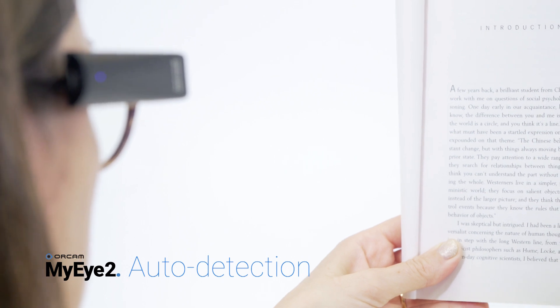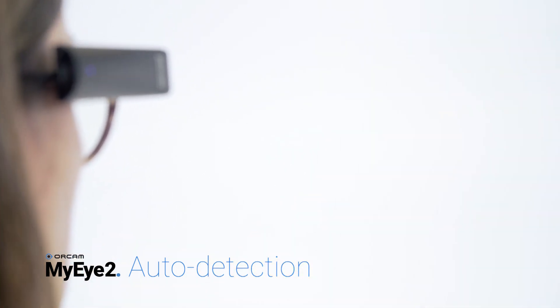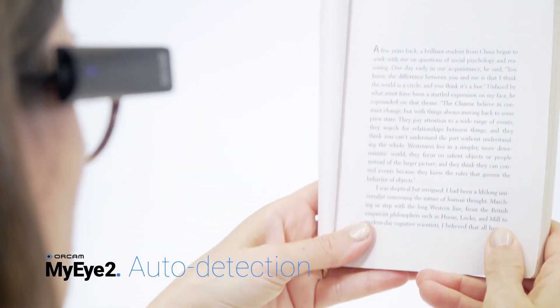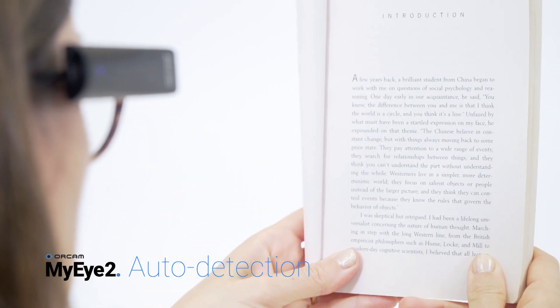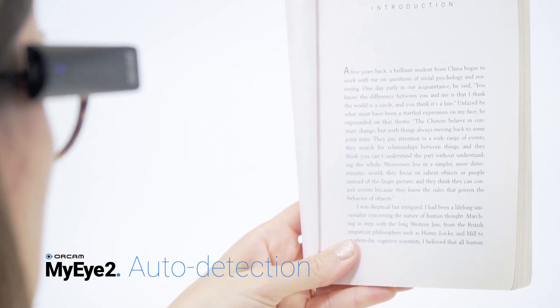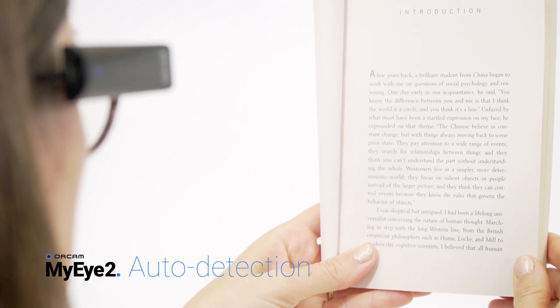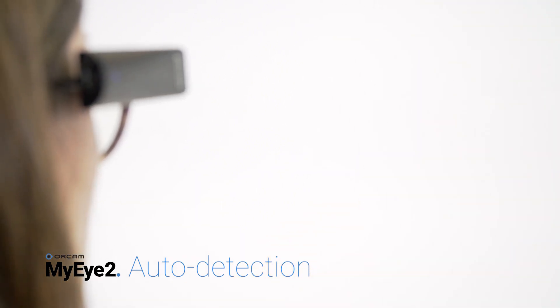Automatic page detection: use this when you wish to read hands-free. Ensure this feature is enabled. Face the text you wish to read and hold it steady for a few seconds. You will hear the camera sound as the device automatically takes a picture of the text. Your device will begin reading the text and sound a chime when it is finished.